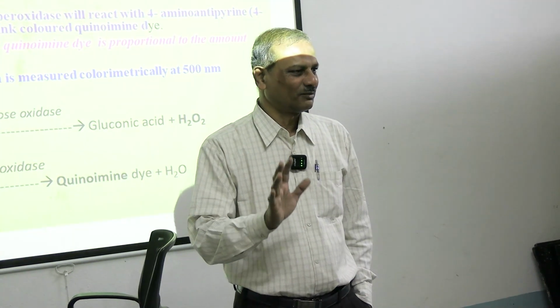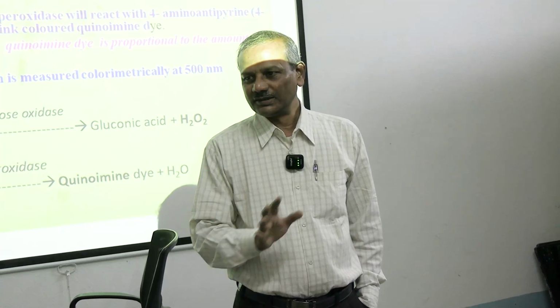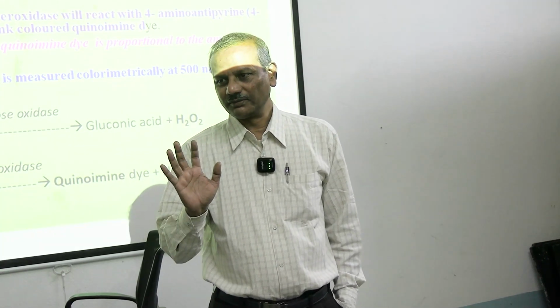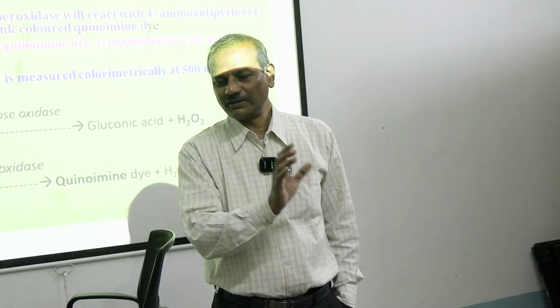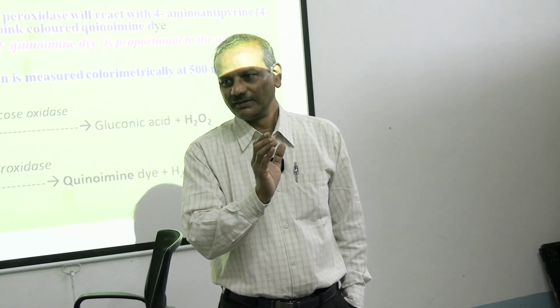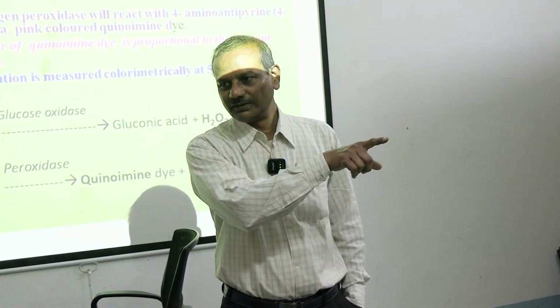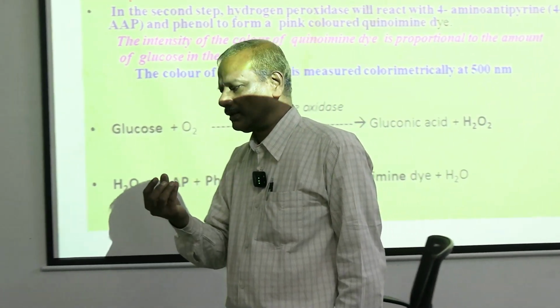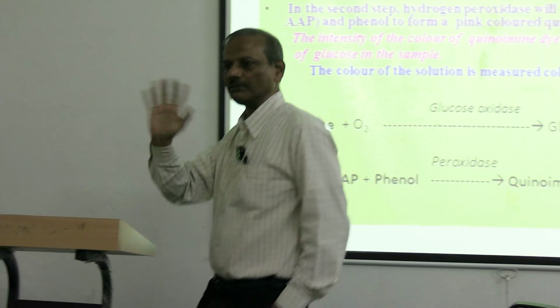But for that, some time is required, and since one class has been covered already, you have to spare some time. I will demonstrate physically, so that you understand the machine very well. Beer's law is central to all biochemical estimation. Without Beer's law, no estimation is possible.